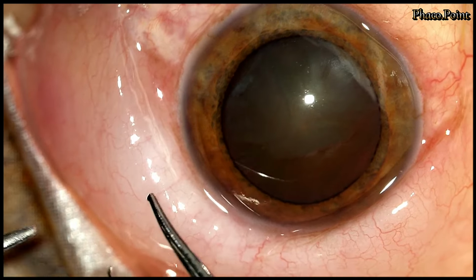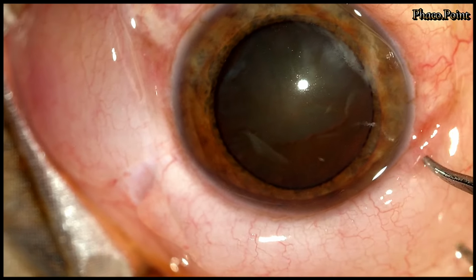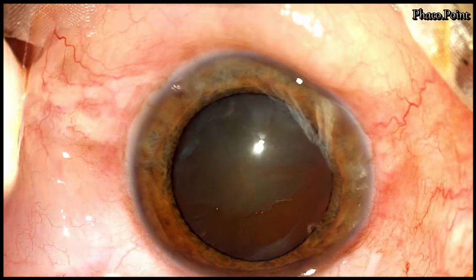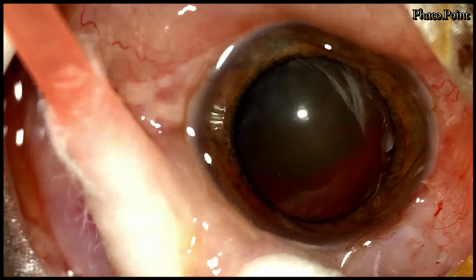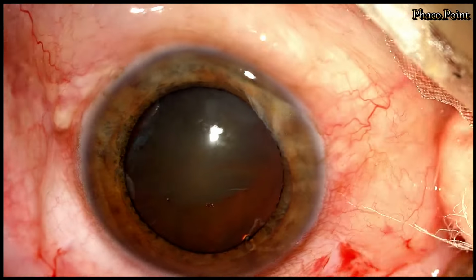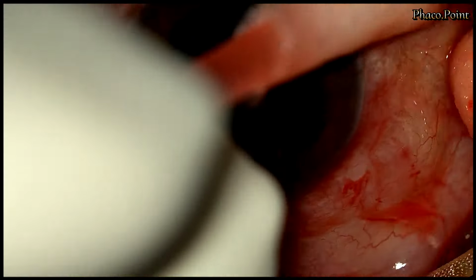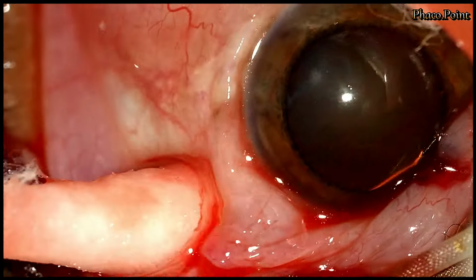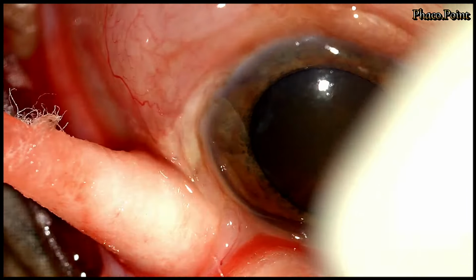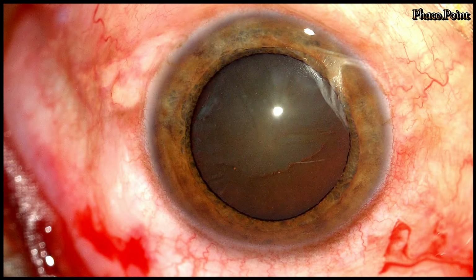Now, in a case with an extensive ballooning like this, I have found that just one radial incision is not adequate. So I make two incisions, one on either side, after which two cotton buds are used which now press on the globe on either side of the radial tear, resulting in the removal of the subconjunctival trapped fluid and a flattening of the conjunctiva. Note that when you make a radial incision, you do not disturb the limbus at all, and at the end of this, you will notice flattened conjunctiva.